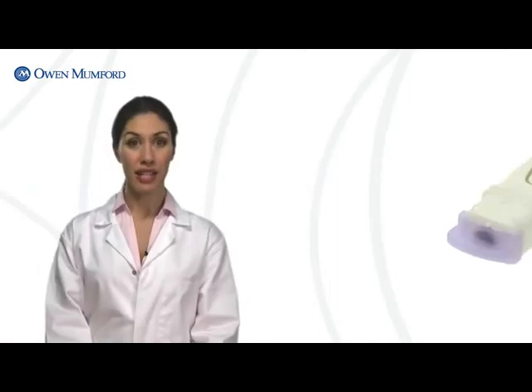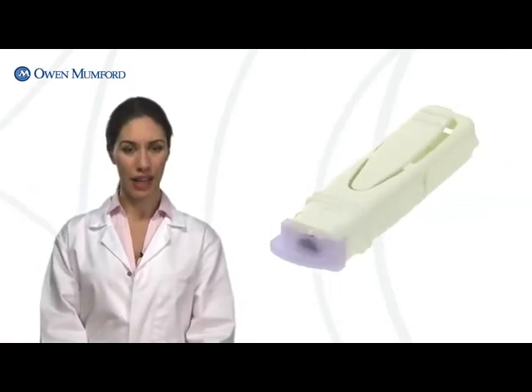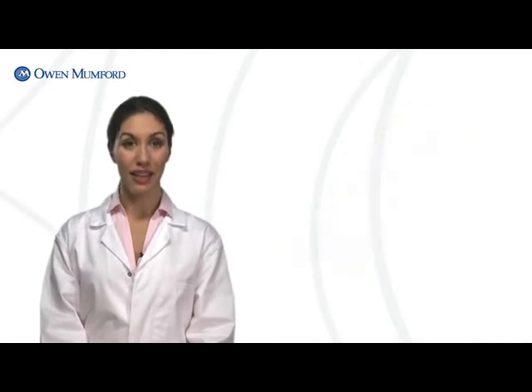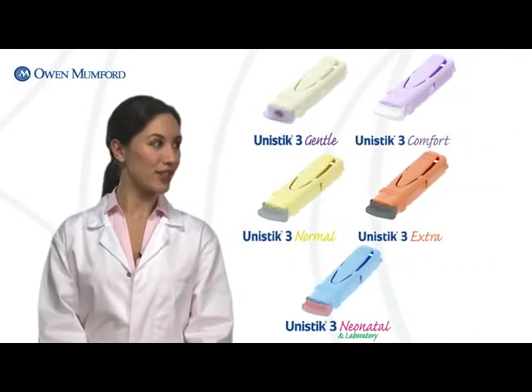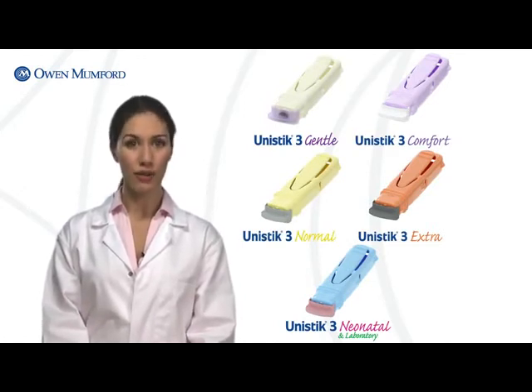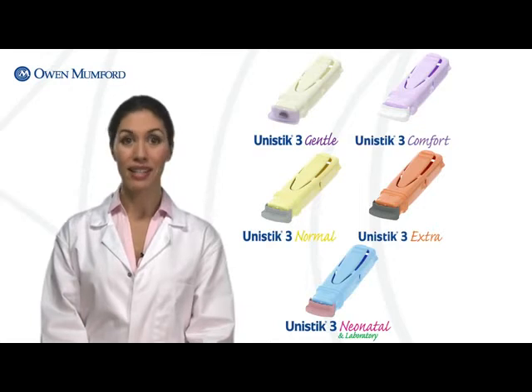This innovative device also benefits the healthcare professional. Unistik3 features a permanently retractable needle to help protect against accidental needle stick and cross-contamination. The line features a comprehensive range of sizes designed to meet every capillary testing need, from high-flow finger sticks to low-flow frequent testing. Sizes are colour-coded for ease and convenience.